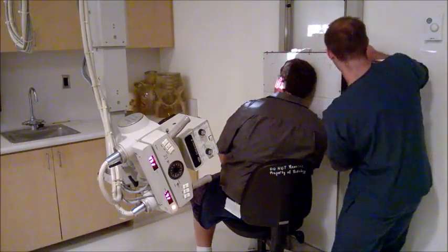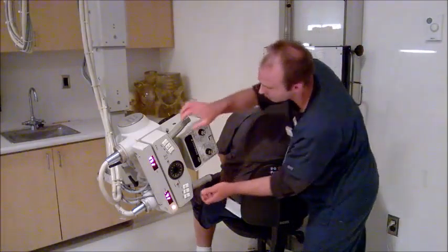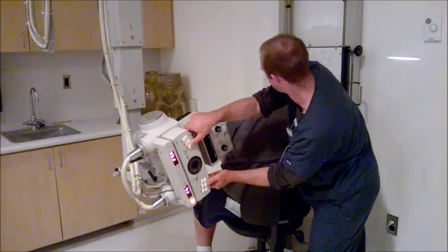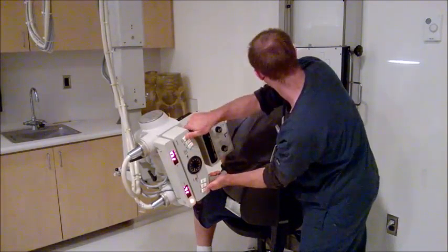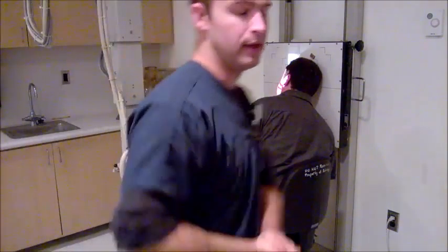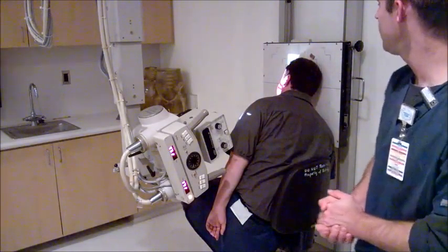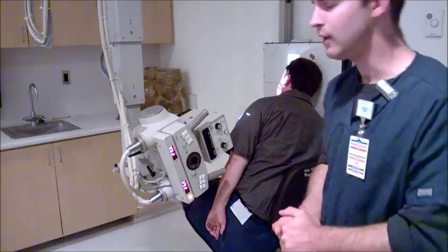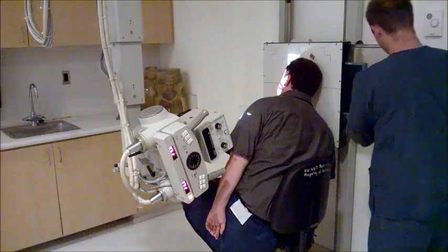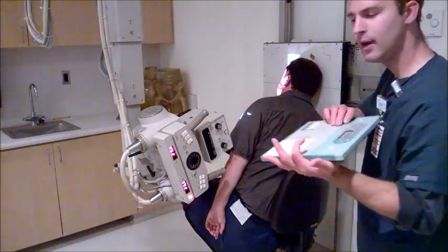And then adjust your IR a little bit higher because it's an angle, and bring it in closer just a wee bit, because it's an axial right now. There we go. Right in between. So the technique would be 70 at 25 for this, the right side mandibular body. So I would take this, of course, I would leave the room and do it. And then I would take it, scan it, and read it.